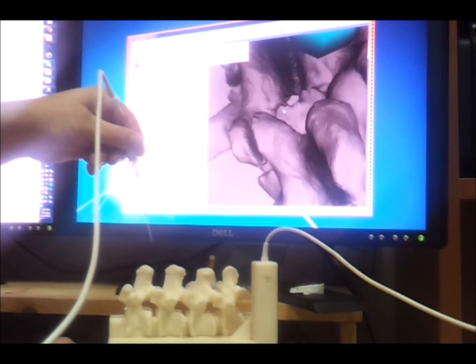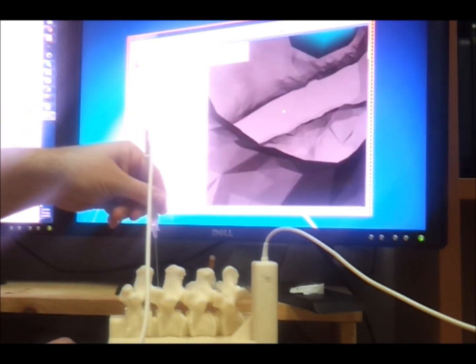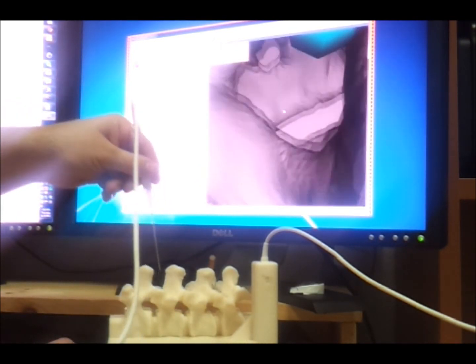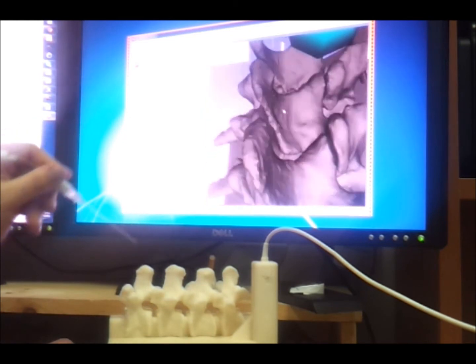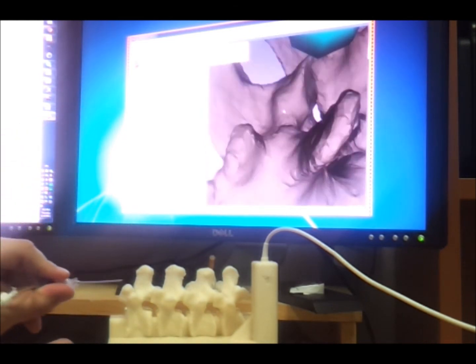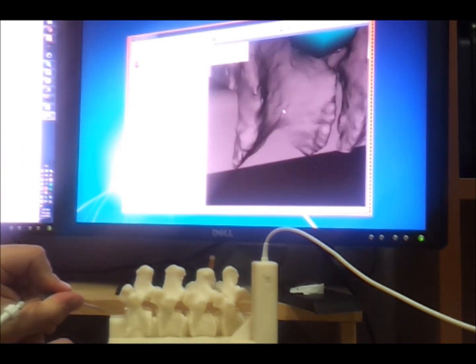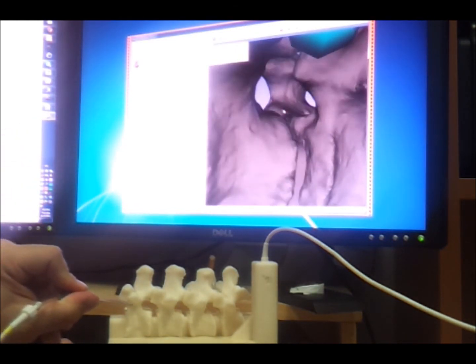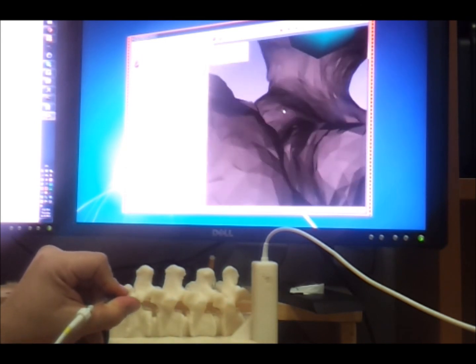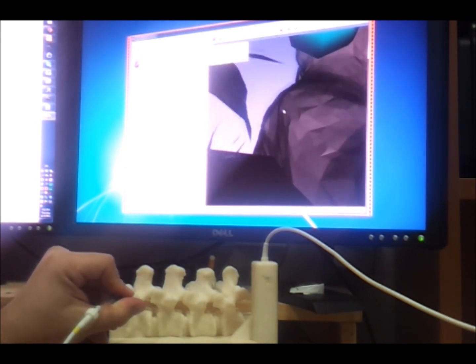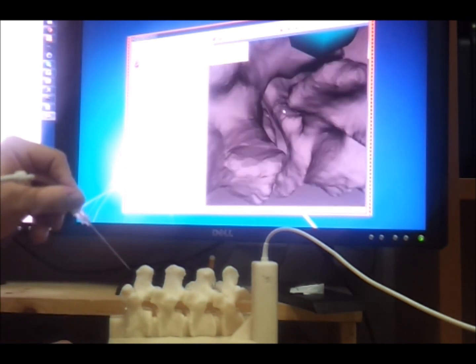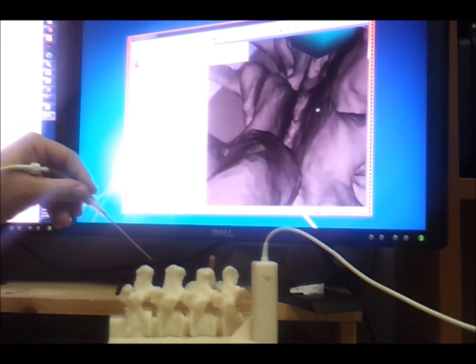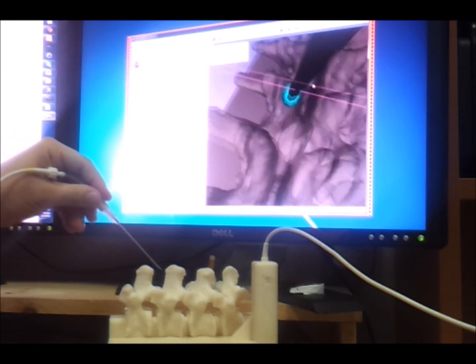Zoomed in like this, I can use the needle as a virtual endoscope, as if the camera was really at the tip of the needle. Now it looks exactly like that.